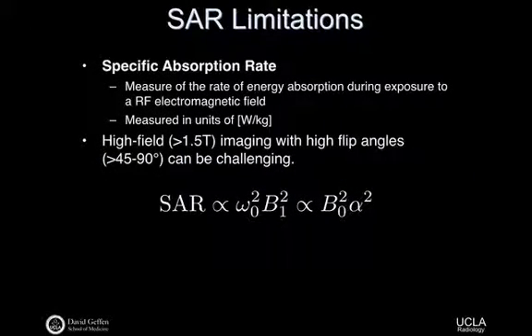we'll go for a bit here. I want to talk about SAR, which has come up before. Does someone want to remind me what SAR is, or what it's related to? Specific absorption rate. What's that? It's a terrible word, I think. What's it related to? Why do we care about it? Patient heating, right? And what are the units we typically use? Watts per kilogram, right? Energy per mass, right? We'll talk some about polarization, something about the design of the RF pulses themselves, which imparts better safety, and a few words about B1 safety itself.